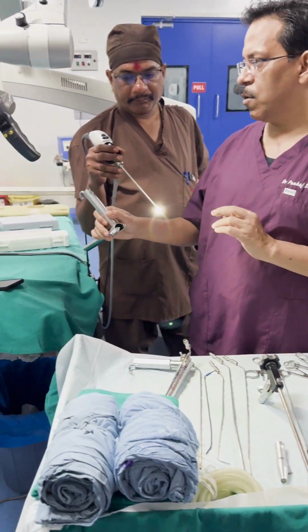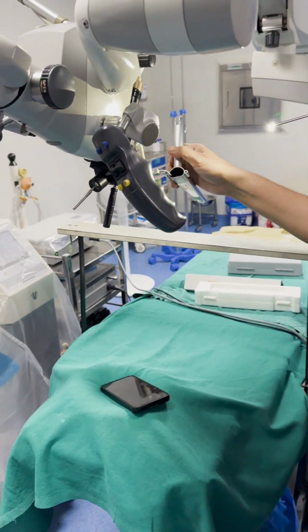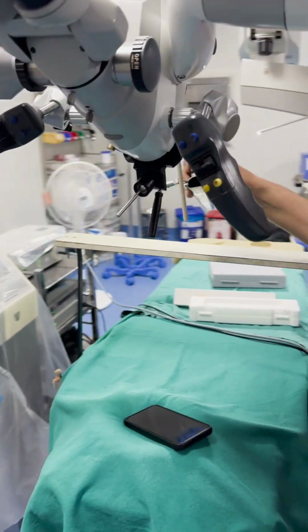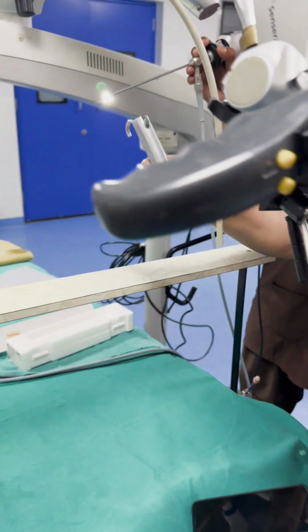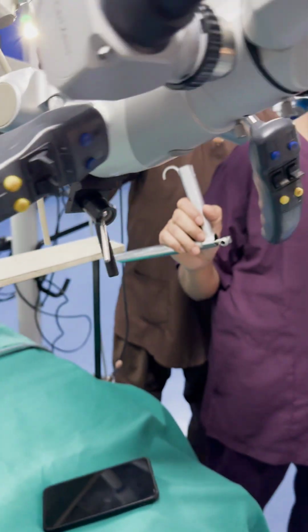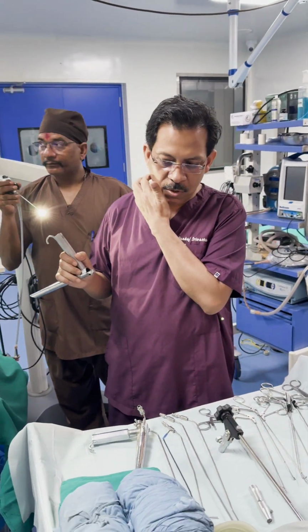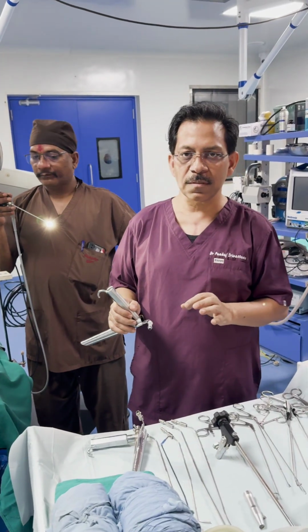So this is how we use it in laser. So laser is attached, microscope attached. If the lesion is visible straight, this is the only option where we can use CO2 laser, because laser cannot be tilted. So this is not possible when the things are not visible straight. So that option, which is best in larynx, is not used.